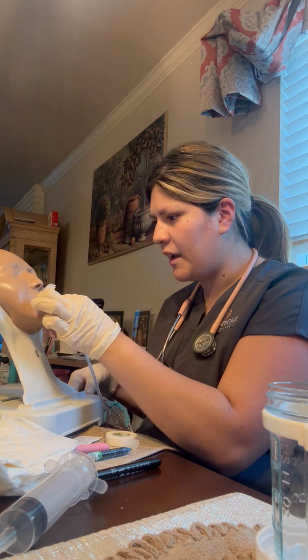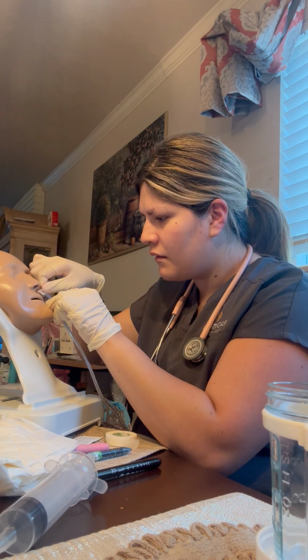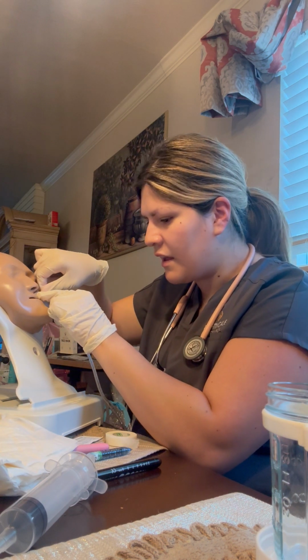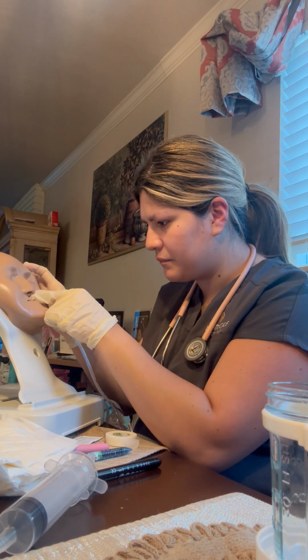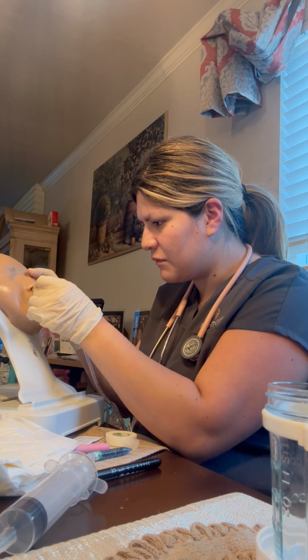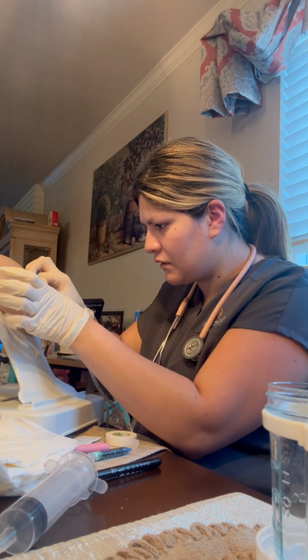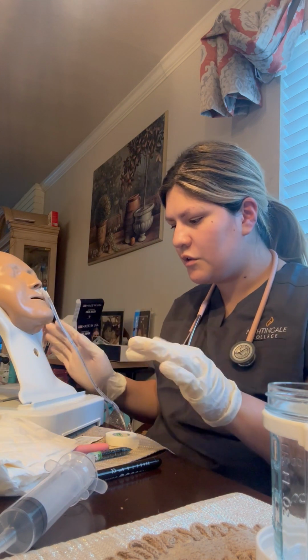I'm going to go ahead and just lightly tape it so that I can check the placement. Okay, so just lightly taping it.